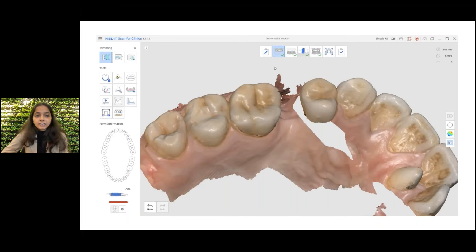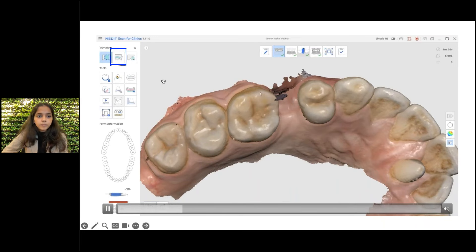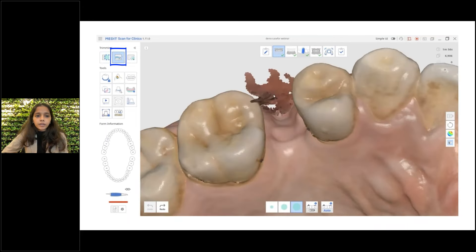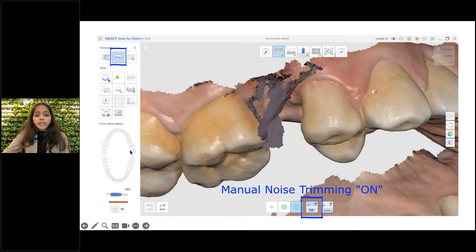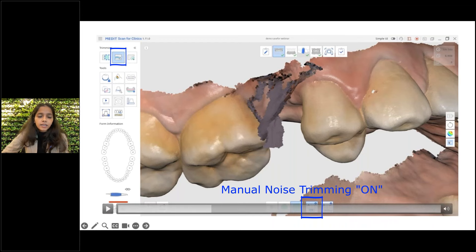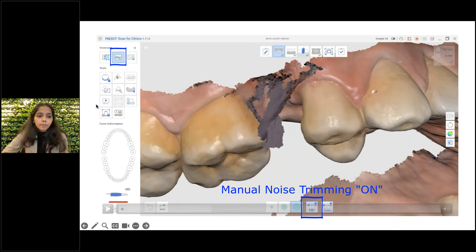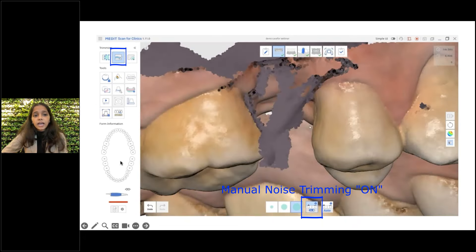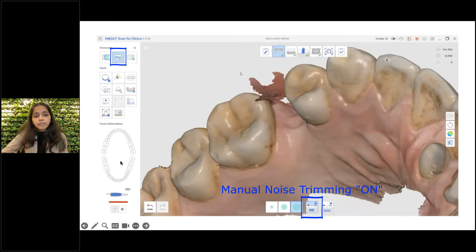To make this easier, we can also use the brush tool. The brush tool is the only tool which can be used to select and trim the intaglio surface of the scan. This can be enabled by using the manual mode of editing in the brush tool. As you see now, I have selected the intaglio surface — and once I select it, the artifact is already gone.